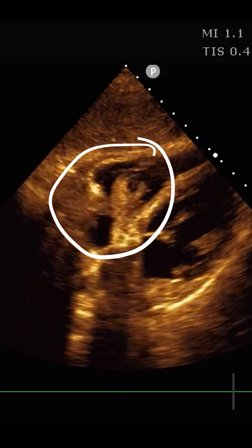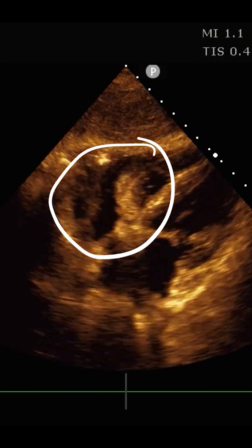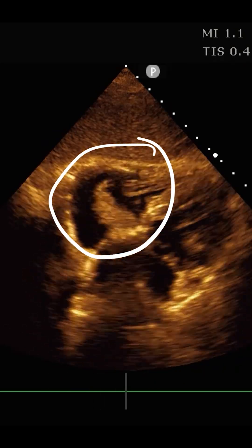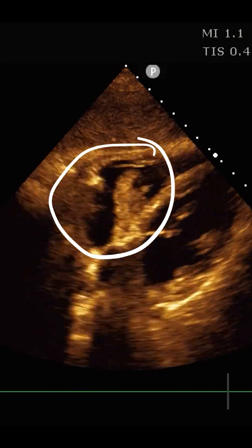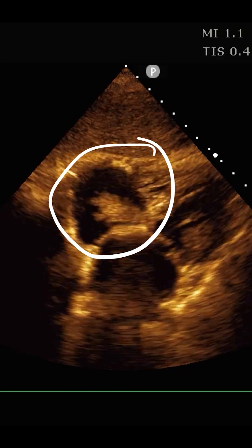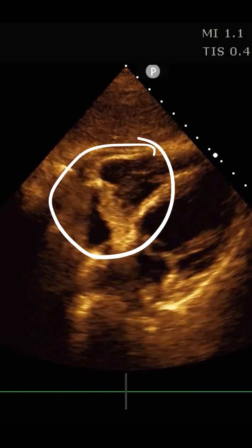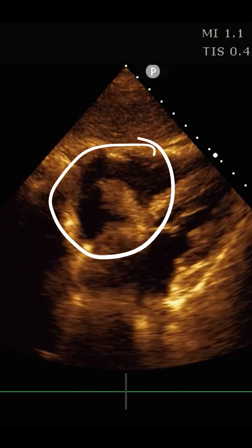Number two: is it a vegetation? As we can see in this clip, it's not necessarily attached to a valve, so maybe less likely. And number three: is it an atrial mass lesion — which is what this one happens to be.